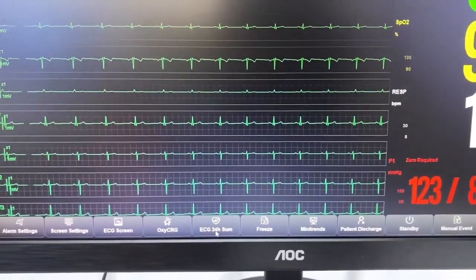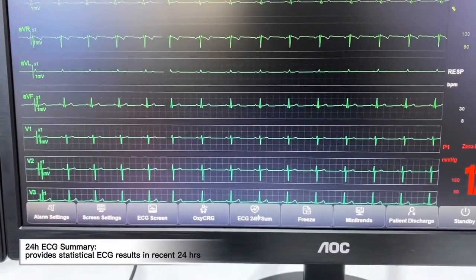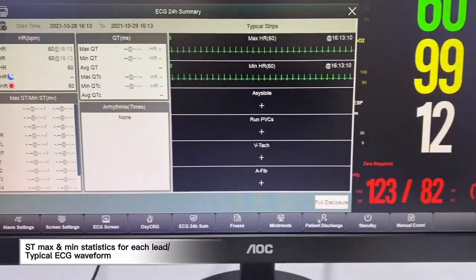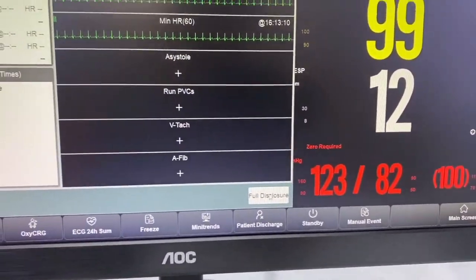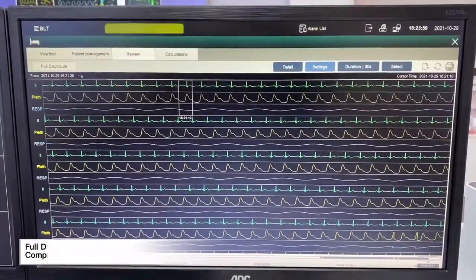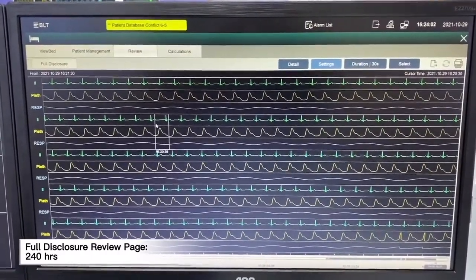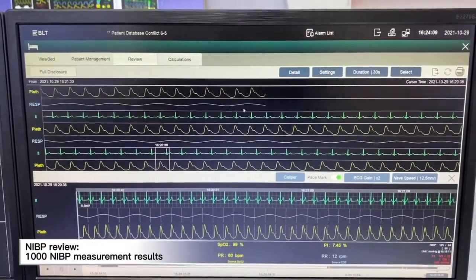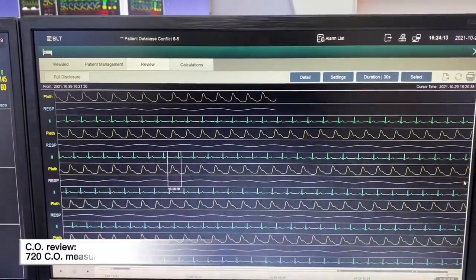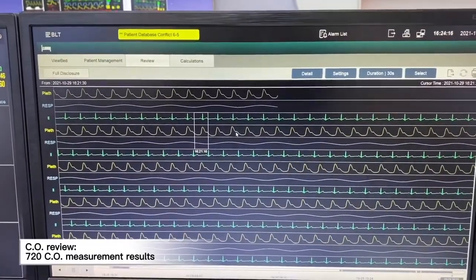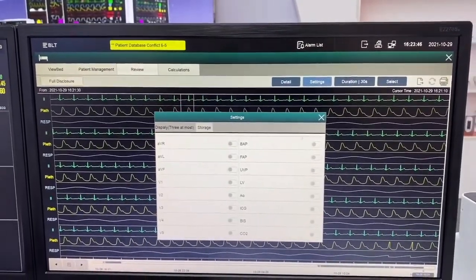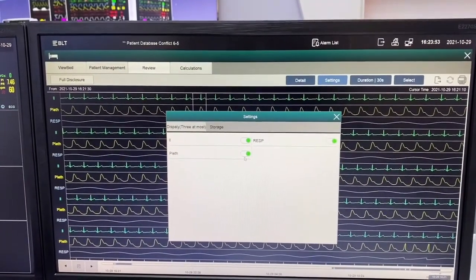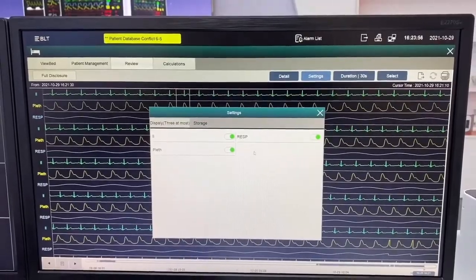After we monitor a patient's ECG for a period of time, we will be able to see the ECG 24-hour summary page. We can open full disclosure, which supports up to 240 hours of full disclosure, 240 hours of trends. For NIBP review it supports up to 1000 NIBP measurement results, and for cardiac output it supports up to 720 cardiac output measurement results. In this full disclosure page we can open all those waveforms in storage, and the display page supports up to 3 waveforms displayed at the same time.